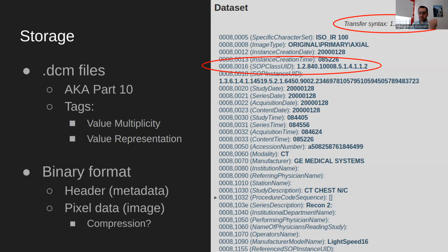If you're a programmer, that's basically the data type. Now, the data types in DICOM don't necessarily map directly to programming data types, but they're pretty close. So you can have types like a date, and in this case, that's the DICOM way of storing dates. So it's year, month, day, without any separators. And then time is the same thing. It's stored as hour, minute, second, without any separators. Do watch out that time in DICOM is actually stored as a float, so you can actually have decimals in there. Not commonly seen, but it's there.